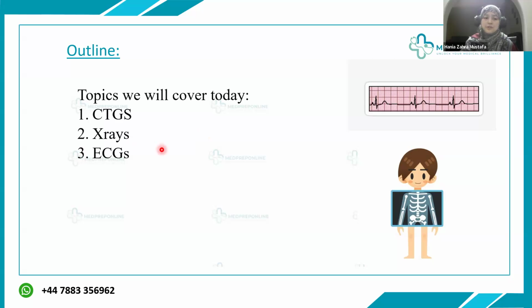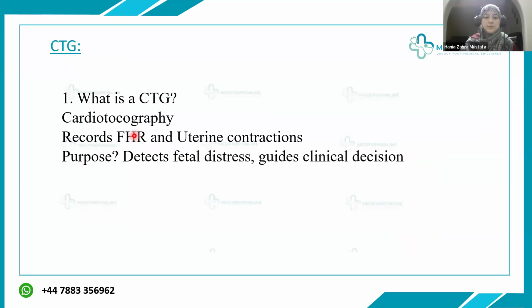I have taken the X-rays and ECGs from your handbook. That will be very helpful for you to review afterwards. Almost all of the X-rays and ECGs are from your handbook. And let's start with the CTGs first.